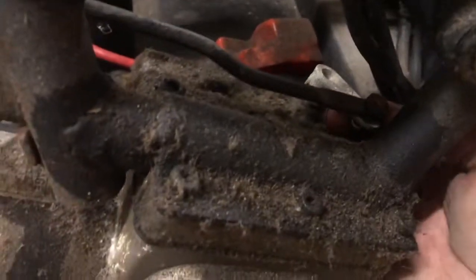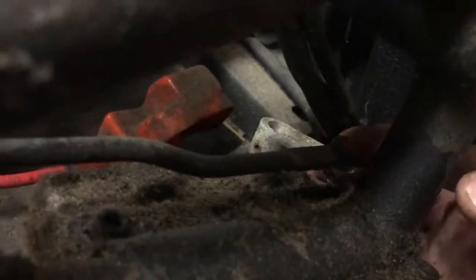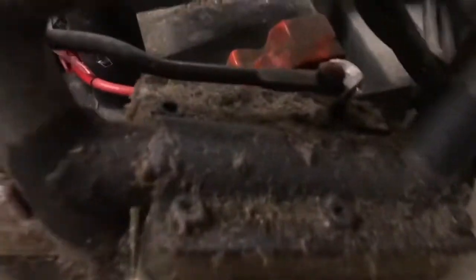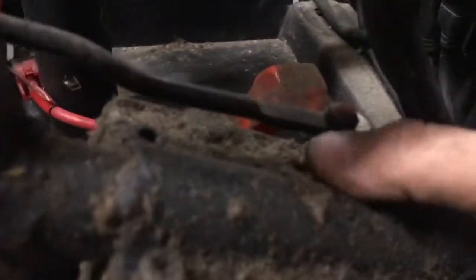But anyway, another thing we'll have to take apart, and different people do different things. You have a lever here that's attached to this. So you can either wait and take it off, or you can do it now. Let me see. What I usually like to do is go ahead and take it off. It's just a pin that's wrapped around this lever. You may have to unlock it to get a better look. There we go. Okay. And you can take a flathead screwdriver and, let me see.